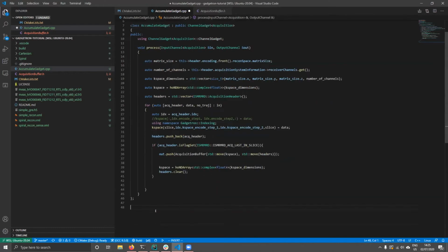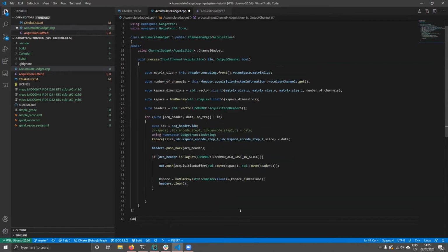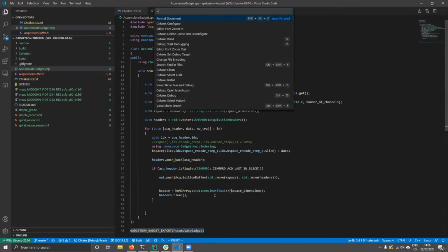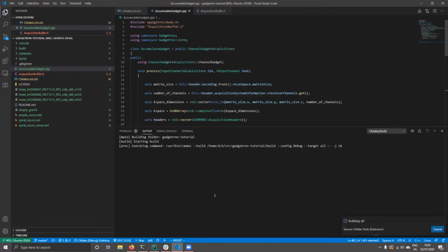Okay, so now we made a gadget. We are lacking one important thing, which is this incantation at the end. So you will see a line like this line or something very close to it in every single gadget. And essentially what it does is it creates a hook that allows us to load this gadget from the DLL or SO file when we are running Gadgetron. So we can go ahead and build to make sure that everybody's nice and happy.